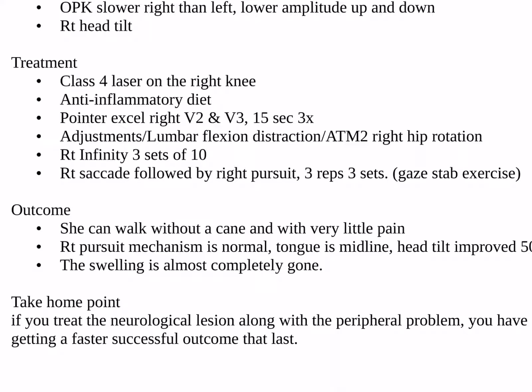I used the ATM2 device, which is an active therapeutic movement device to help stabilize unstable joints or help joints and articulations that are painful to move, without the pain. And it's really, really outstanding. I can't recommend that enough. We did some right infinity with the arm and leg in counter phase, 3 sets of 10, and she also does those at home.